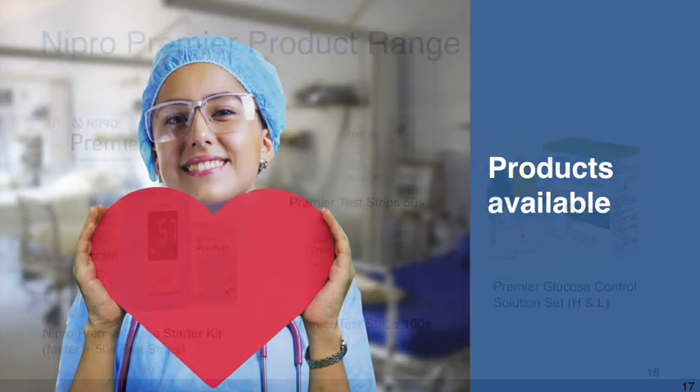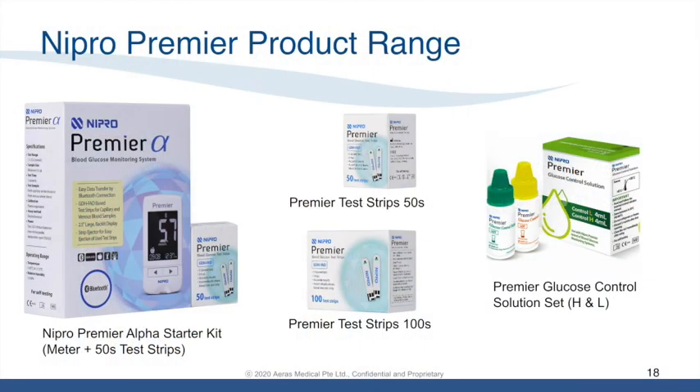Nipro Premier Alpha product range includes the starter kit, which is a meter with 50 test strips sold together. There are also Premier test strips sold in 50-strip or 100-strip packaging. Should your hospital or institution require a QC check, control solution is available for purchase.